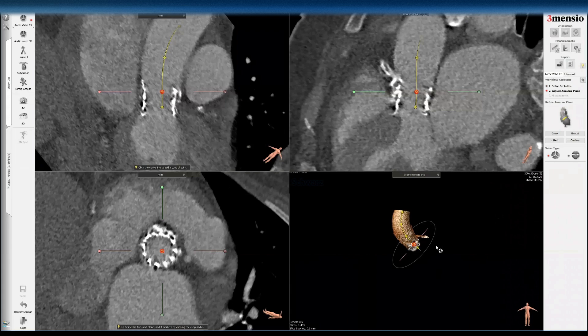Another issue with redo TAVR CT workup is that transcatheter valves, when deployed, are not always parallel to the annular plane. Sometimes they are pivoted, canted, or deeper on one side and higher on the other. So we focus on the centerline of the transcatheter valve when evaluating feasibility, mostly related to risk of coronary obstruction and sinus sequestration — similar to what we do with TAVR in surgical valves.